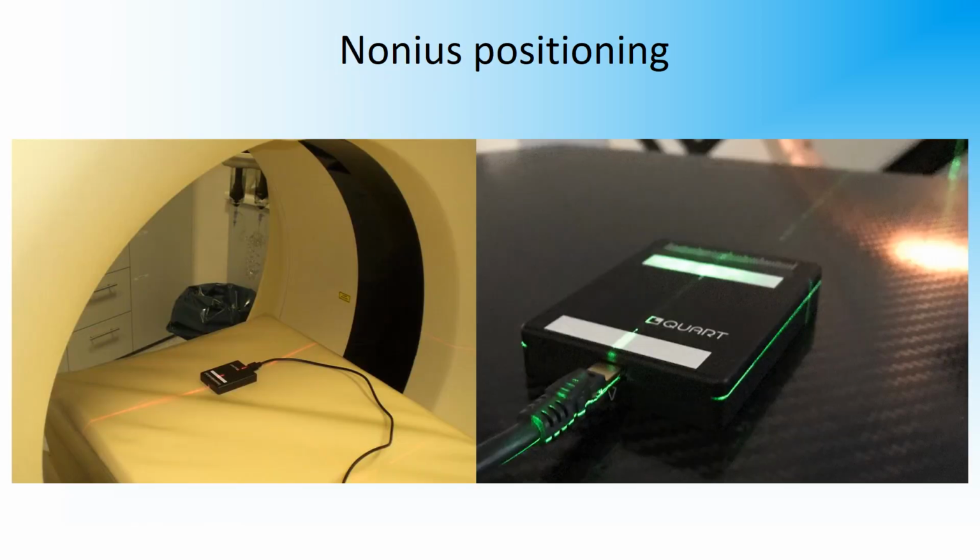The Nonius device has a linear array of detectors that can be positioned either in a radiation field or fan beam region or on the edge of a fan beam. There are various markings on the cover to allow for correct positioning.